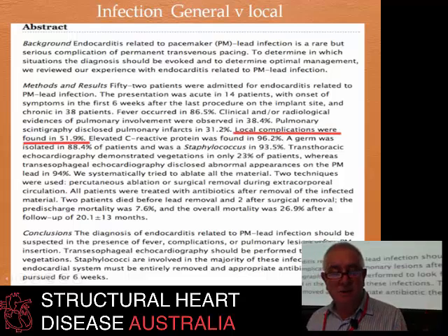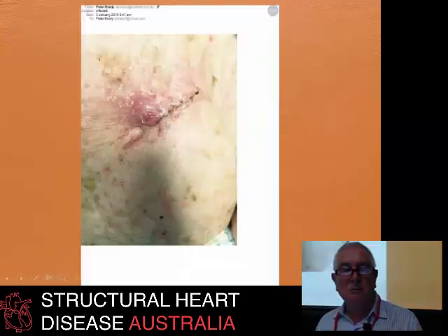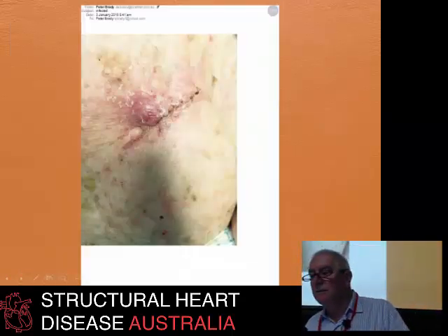So even though these patients had infected pacing systems, there was only external evidence of that in approximately half the patients. And interestingly, transthoracic echo demonstrated vegetations in only about a quarter, whereas TOE increased that number to pretty close to 100% when they were present. So I think it speaks volumes for having a thorough investigation of these patients, which would include transesophageal echo.